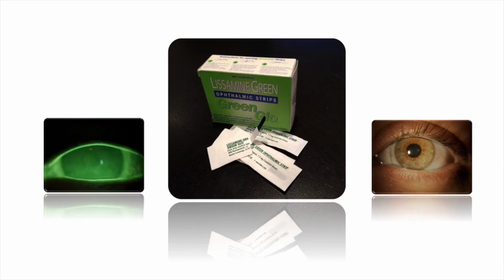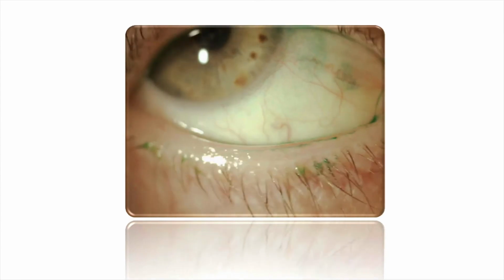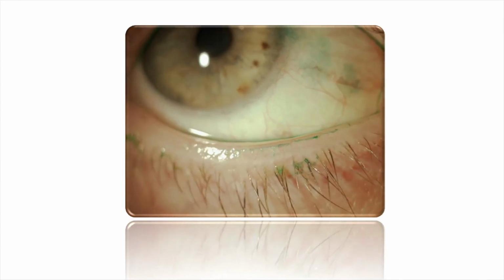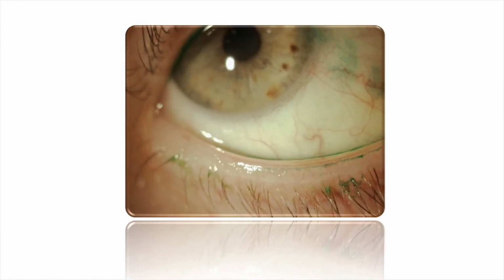Although Lissamine green can stain the cornea, we reserve it primarily in our practices to view the conjunctiva, and then we use sodium fluorescein instead to view the cornea. When we instill Lissamine green, we typically like to observe it within the first 1 to 2 minutes.